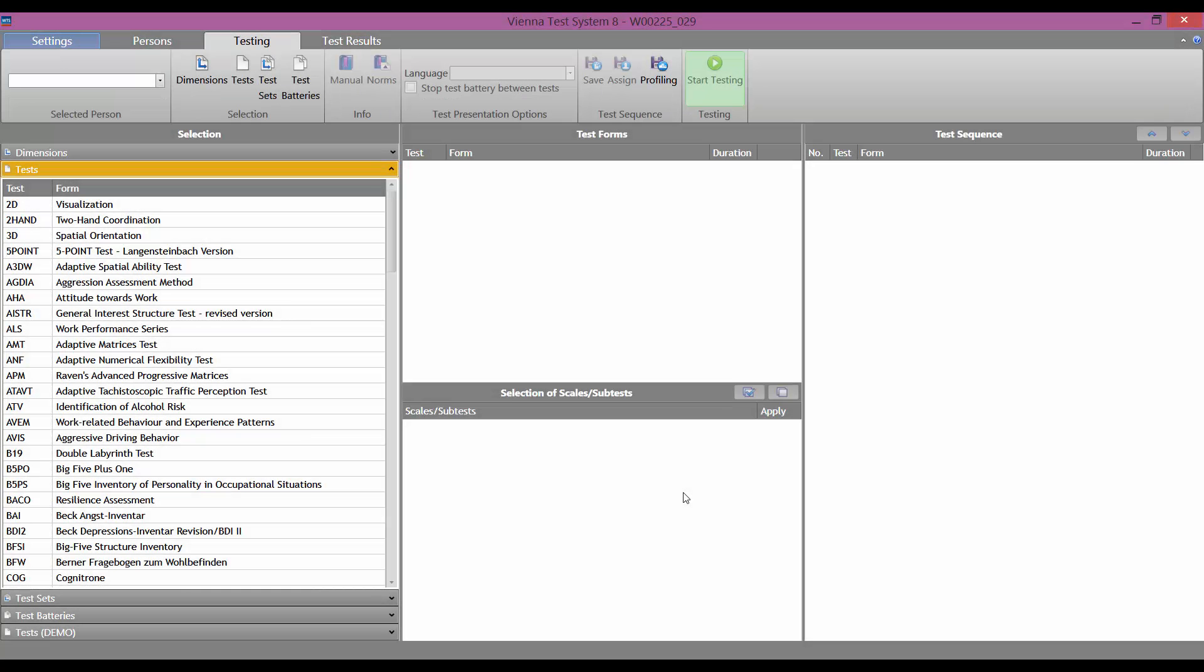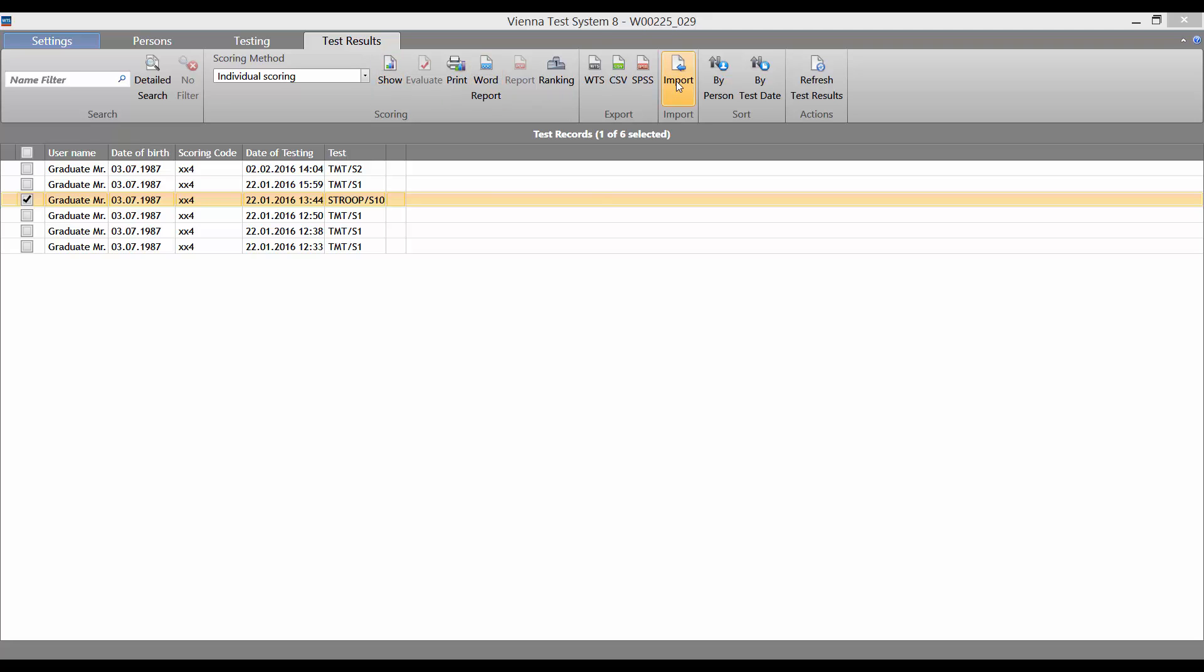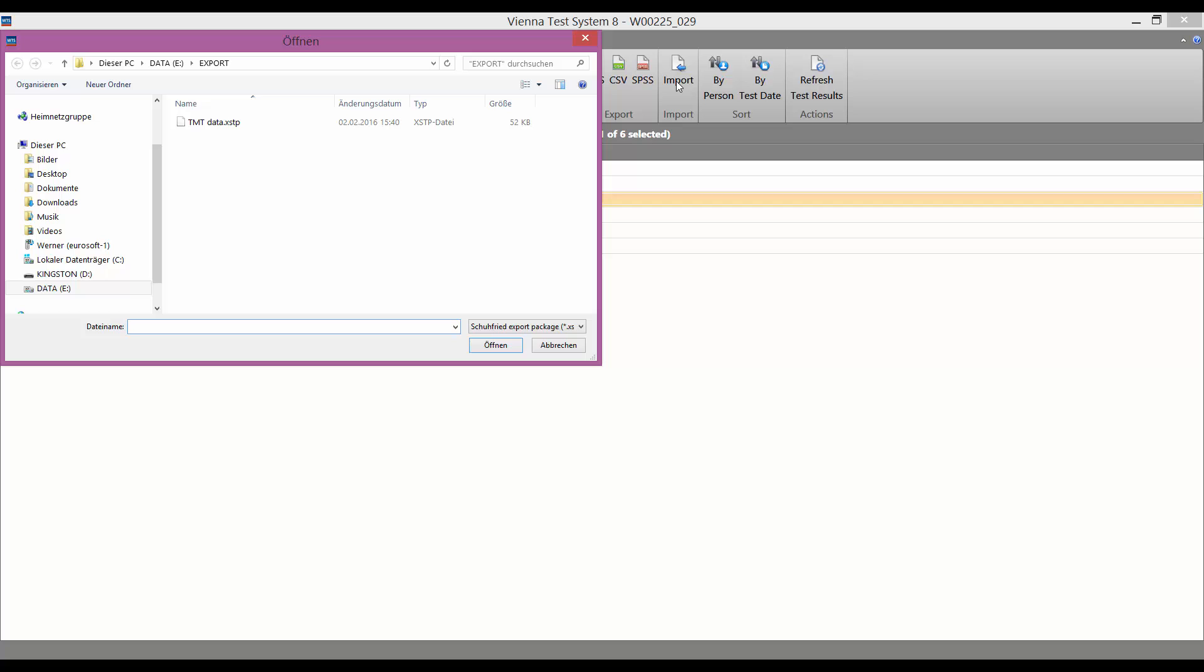Importing test results from another test system is also straightforward. Once again, we go to the test results tab and then click on the import button. Here we can select the file that we want to import.